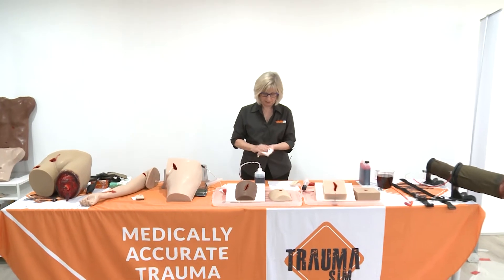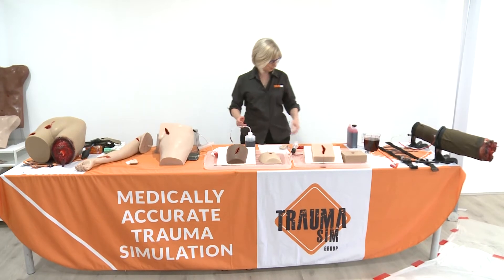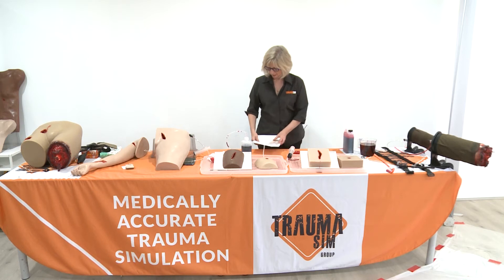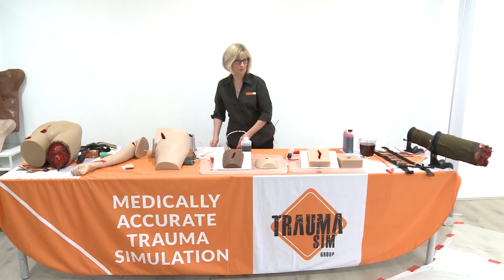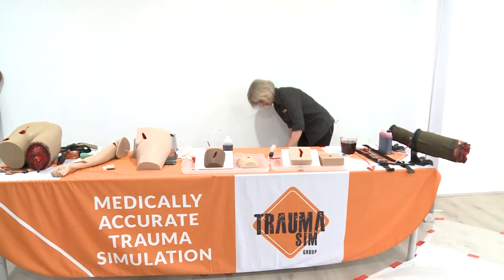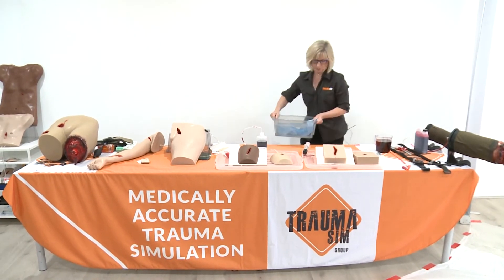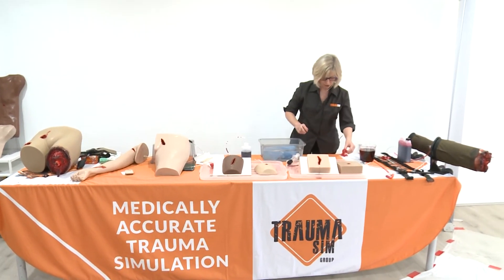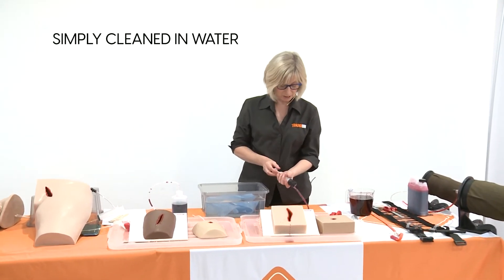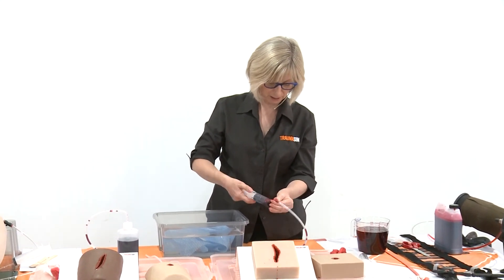The other thing I haven't shown you is how to clean this all up when you're finished. A lot of people who are having to look at haemorrhage control training aids for the first time in their training are a little bit nervous about how they're going to make all that work indoors, but it's not that difficult. I've got just a bucket of water here, but you can run them under the tap — they're very robust. I tend to save the blood if I'm training for a few days in a row so you're not wasting it.